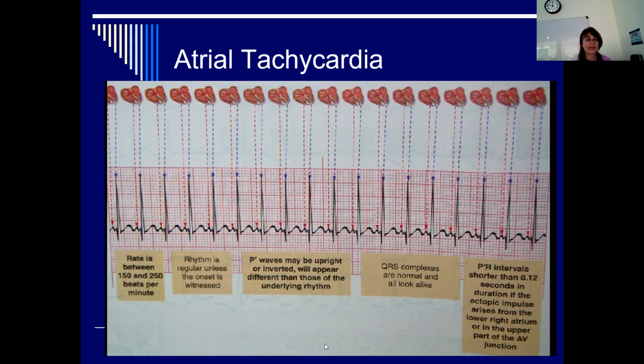But on here we can see the P waves. That's pretty cool. If it's not irregular, like if it's even, can we just half it and count half and check it by 2? Yes. And how do you know where half is? Yes. So there's a line every 15 boxes.